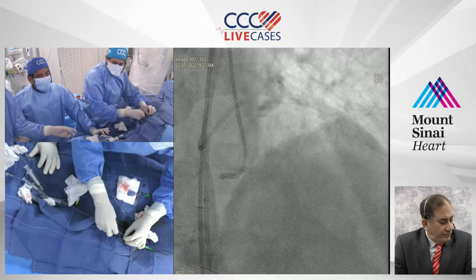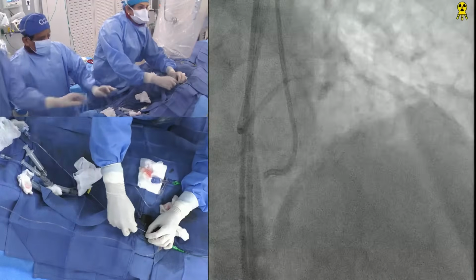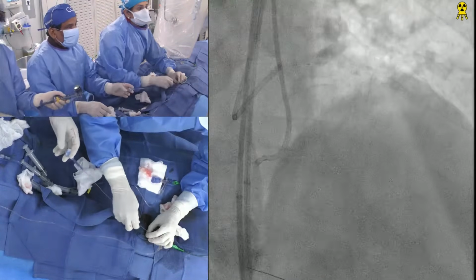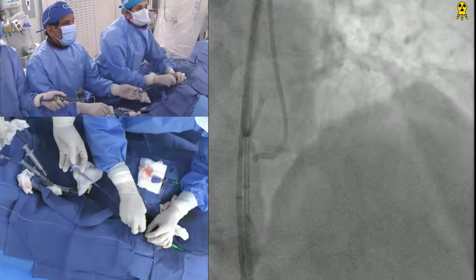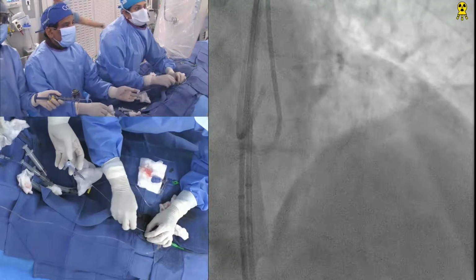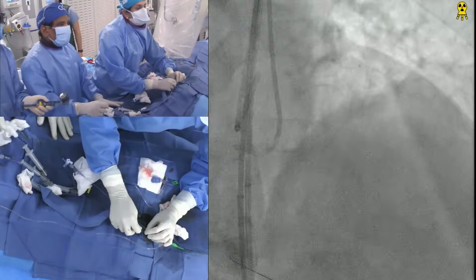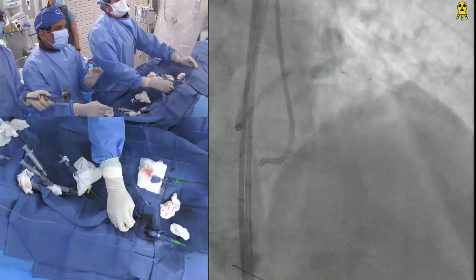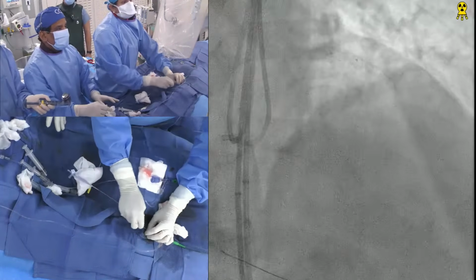No, I think, remember, no matter how you do a POT, kissing balloon and all, once you went to the stent struts, the integrity, you actually take away, I would say, polymer, take away some part of the drug, and they always come back at that bifurcation level. And that is why all the trials of stenting across, that if you don't need it, don't do a routine kissing, is based on that factor. If you start doing a routine kissing, it is troublesome and doesn't help you.